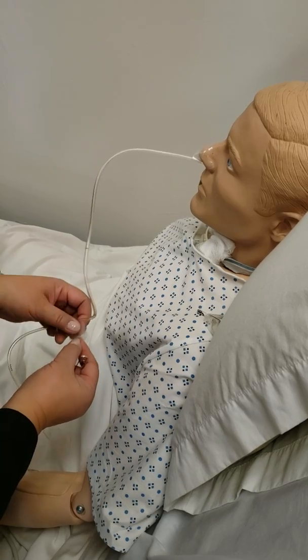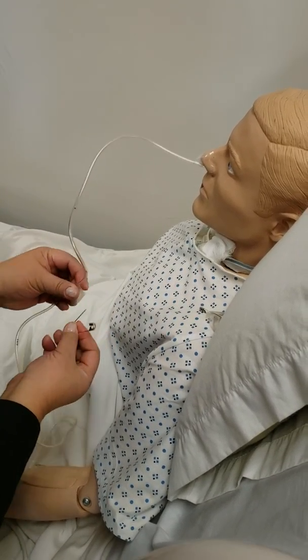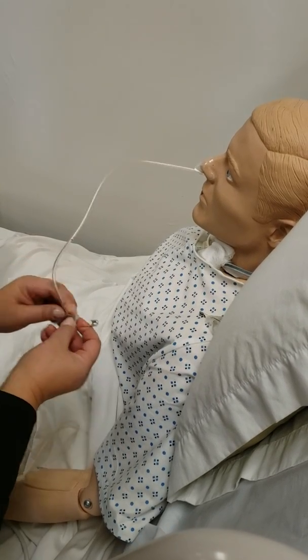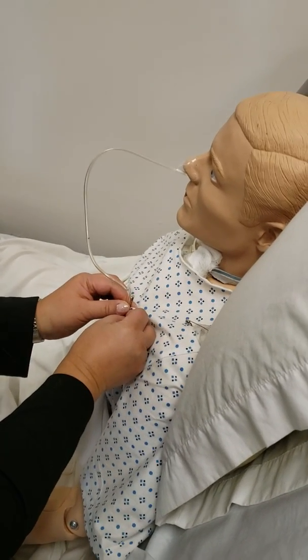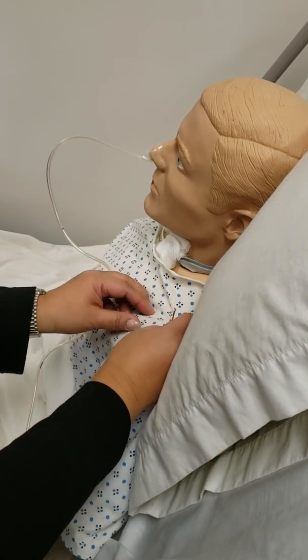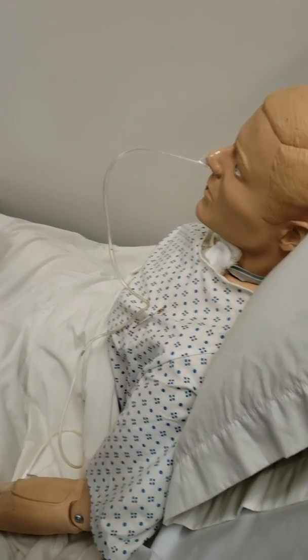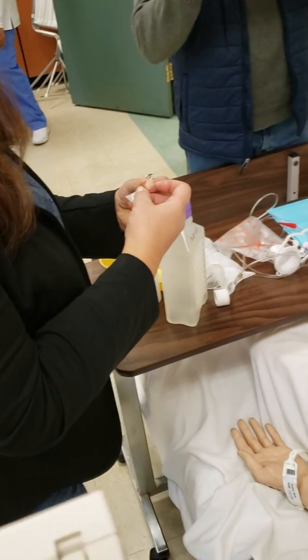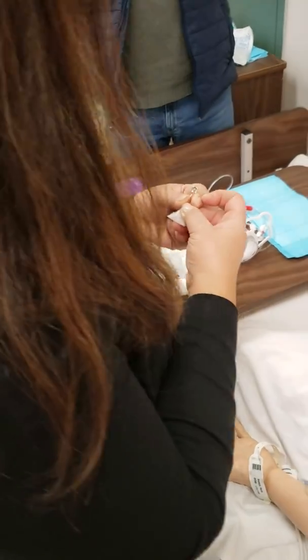And it's the pin. We pin this on the patient's gown. There's a pin right there too. Anyways, we have extra pin. All right, it's broken. You throw it away.